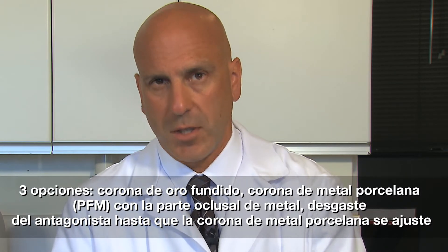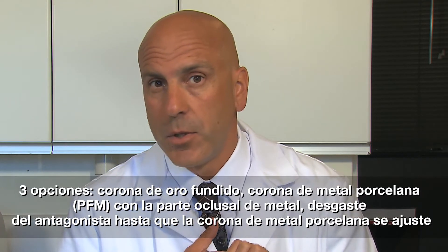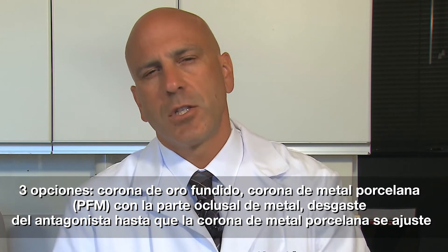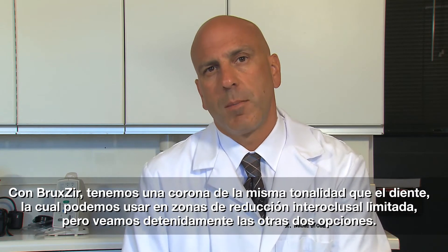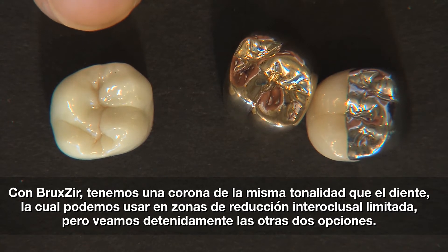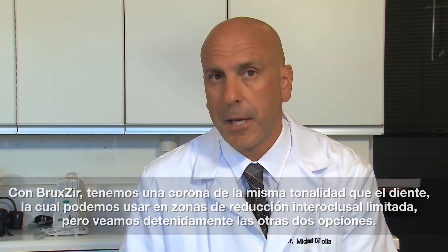Patients don't really enjoy having their opposing teeth ground down to make room for the new crown. And more and more patients are objecting to cast gold crowns — which I don't happen to agree with, but this is the patient's choice, not mine. And patients aren't real big on a PFM crown that's got a big metal occlusal either. So with a BruxZir homogeneous 100% zirconia-based restoration, we now have the ability to use something in those areas of limited interocclusal reduction that is still tooth-colored. Let's take a closer look at those three options.